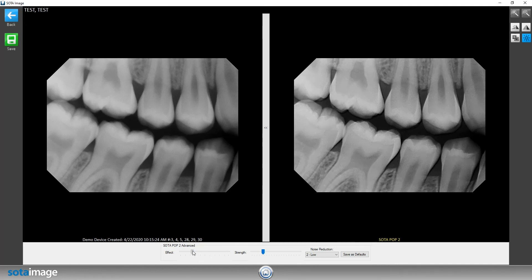Changing any of these sliders is going to affect the way that the image over on the right will appear. As you can see, as I move these sliders around the filtered image is being manipulated. All three of those settings — effect, strength, and noise reduction — combined will generate our filter tuner options.